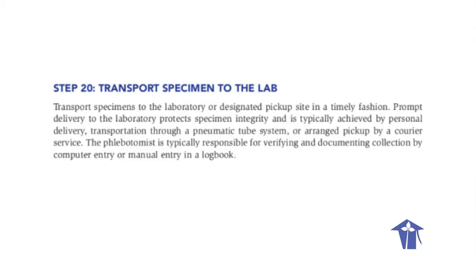Step 20, transport specimen to the lab. Transport specimens to the laboratory or designated pickup site in a timely fashion. Prompt delivery to the laboratory protects specimen integrity and is typically achieved by personal delivery, transportation through a pneumatic tube system, or arranged pickup by a courier service. The phlebotomist is typically responsible for verifying and documenting collection by computer entry or manual entry in a logbook.